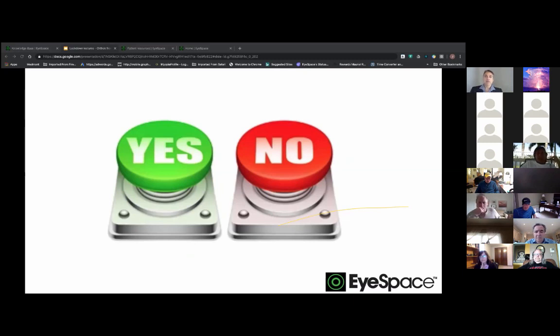What about introducing hyperopic compound astigmatic fits? Let's start playing a bit more with irregular LASIKs. Then you start expanding those cases that you shouldn't do, but only if you have a lot of experience and you understand that there's a higher risk of not getting to the perfect reshape at the end of the day. But for me, that's the guideline of fitting ranges that we should be dealing with.